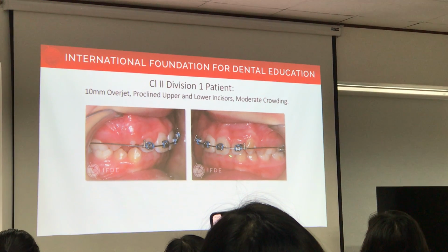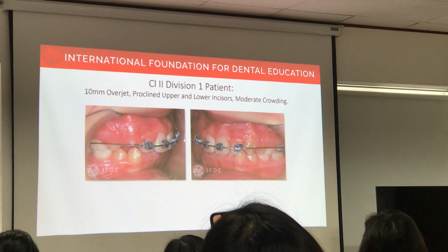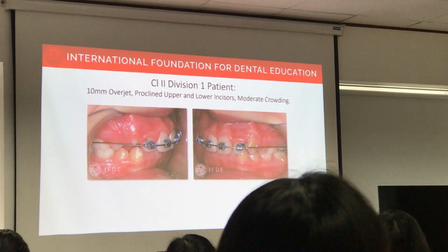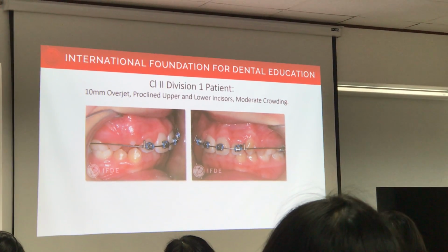But she has exactly what we've been practicing. She has a 2x4, and I use the surgical hooks here. And you see the headgear effect is pretty cool. And I haven't done anything on the lower yet.